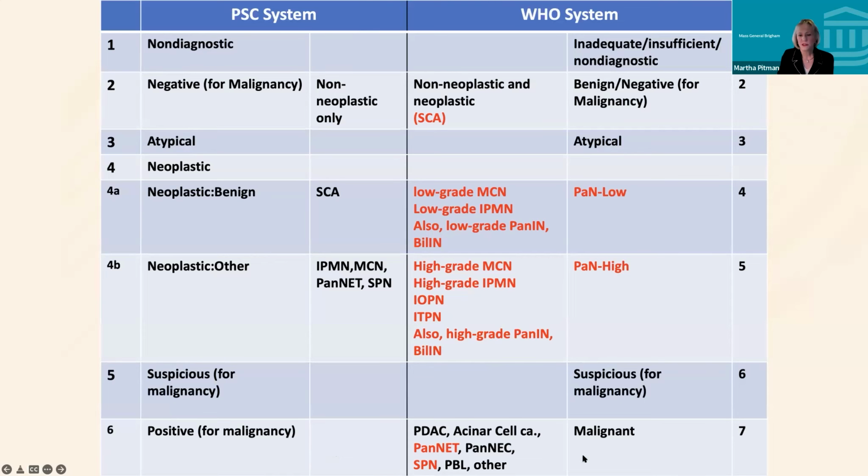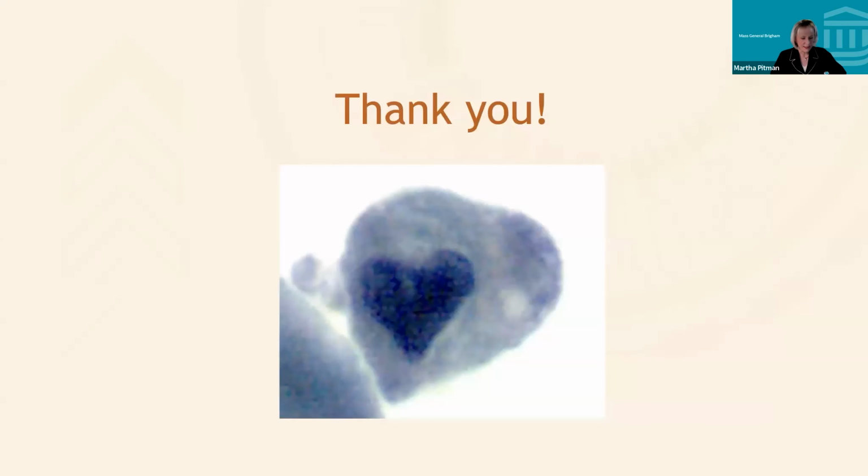And then we have our suspicious and our malignant category, where now neuroendocrine tumors and solid pseudopapillary neoplasms are in the malignant category. So with that, I think I'm exactly on an hour. I hope I still have time to take questions if you have any. Thank you very much for your attention.